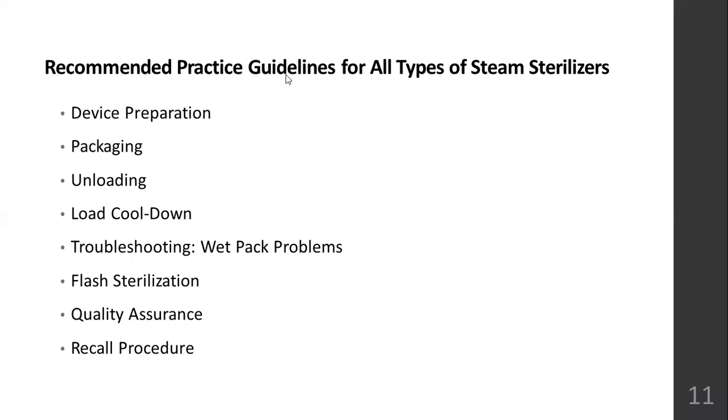Then unloading, do not open any autoclaves or hot air oven when the temperature is still high. You have to allow the load to cool down, and then open it. Then open the chamber. Otherwise, it will damage. The sudden gush of cold air will damage the items which are kept inside.